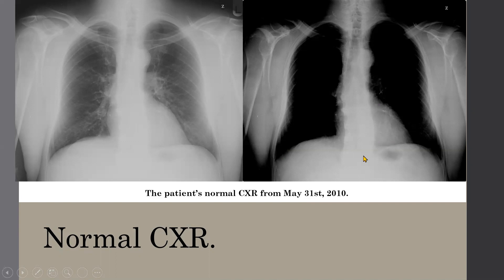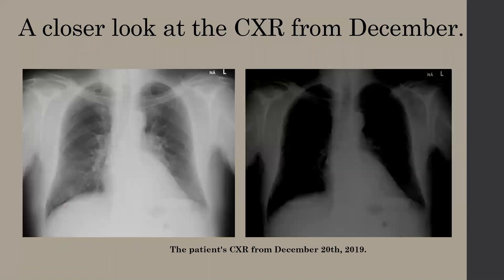Comparing to the image from the day he went to the ER, those two same features are not the same. Here, the outline of the vertebra is obscured — you can't delineate it. And there's an opacity behind the heart, a quite triangular-shaped opacity.